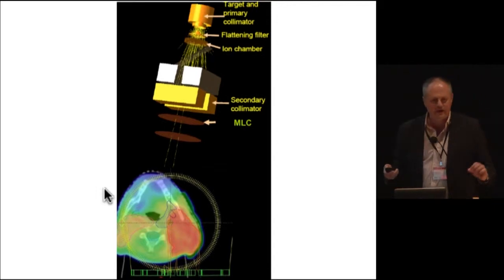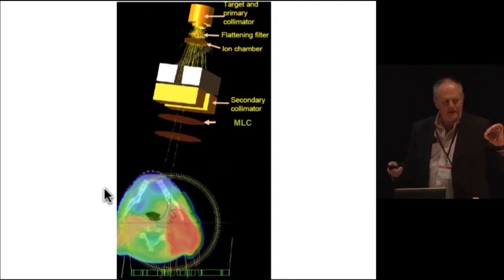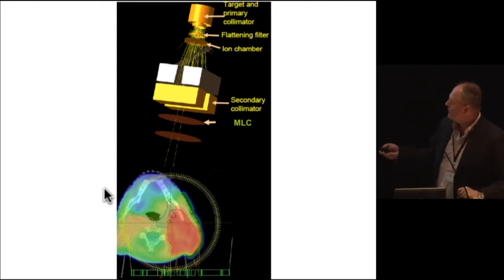Once a particle passes through a sync type component module, it acquires an MU index and selects a specific aperture, and all the sync modules downstream are given the same MU index and therefore the corresponding aperture.